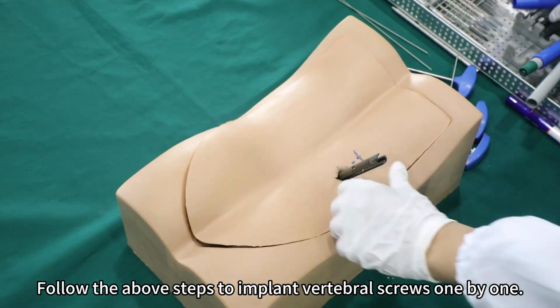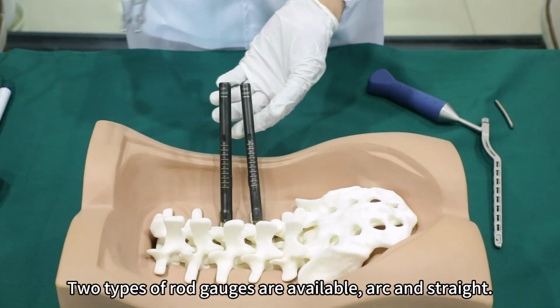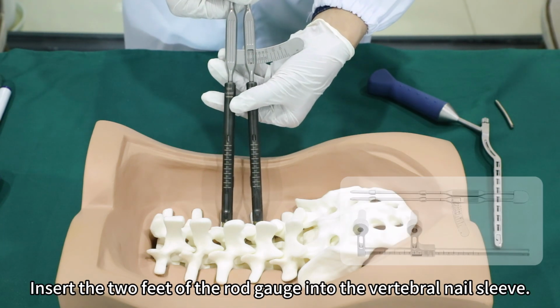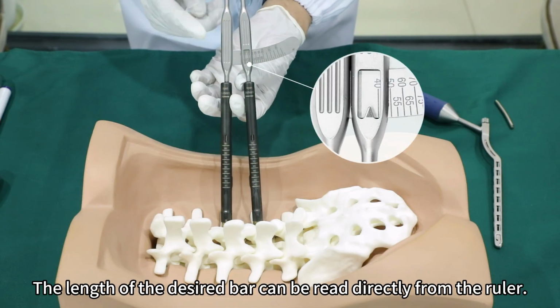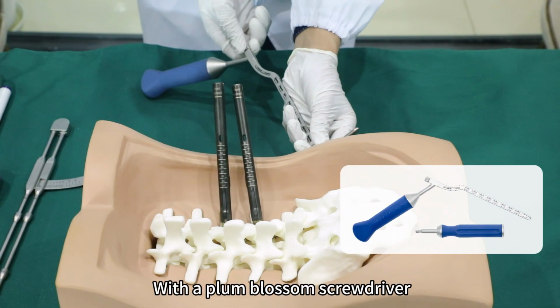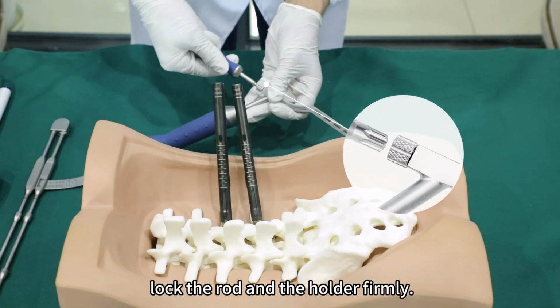Follow the above steps to implant vertebral screws one by one. Two types of rod gauges are available, arc and straight. Insert the two feet of the rod gauge into the vertebral nail sleeve. The length of the desired rod can be read directly from the ruler. The length of the selected rod cannot be less than the scale reading. Connect the rod to the rod holder. With a plum blossom screwdriver, lock the rod and the holder firmly.